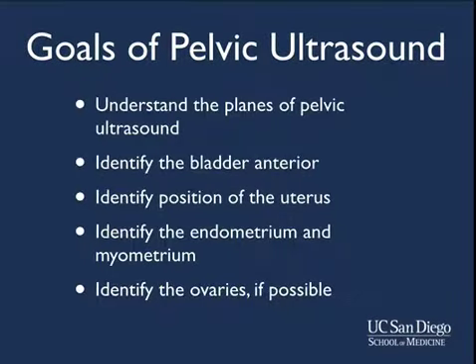The goals of pelvic ultrasound will be to understand the planes of pelvic ultrasound, to identify the bladder anterior, to identify the position of the uterus, and within the uterus to identify the echogenic endometrium and the myometrium. Finally, we will identify the ovaries if possible.